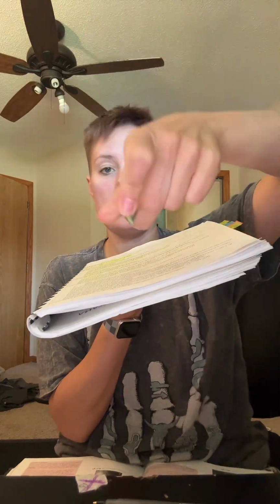LPO axial projection, left side down. Up the butt, so here's your central ray. Up the butt for the LPO. LPO, left butt cheek. LPO, up the butt. How many times have I said butt? Okay, let's flip it. RAO, out the ass. Your central ray is going to go out the ass. So down, that way. Anyway, that was really confusing. But, left butt cheek, right asshole. Up the butt, out the ass. That's how you're going to remember those axial projections.